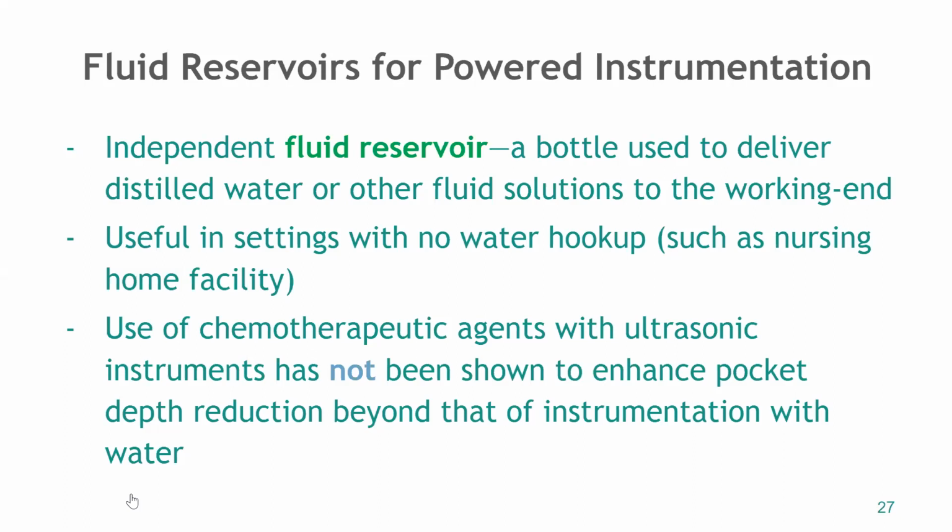Personally, I don't do that just because if you have a fluid reservoir, it's important that you change it often. If it's a big fluid reservoir, sometimes you have to just waste it, dump it out. If it's too small of a reservoir, then you're filling it up all the time. Usually that's the problem, that it's too small and you have to fill it up like 5 times a day and it's just a pain. But again, great for settings where there's no water hookup. Ours in the clinic will not use fluid reservoirs. They'll just plug directly into your unit and use the water source from your unit.